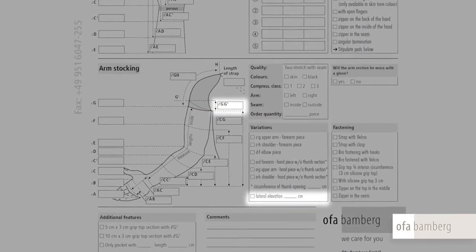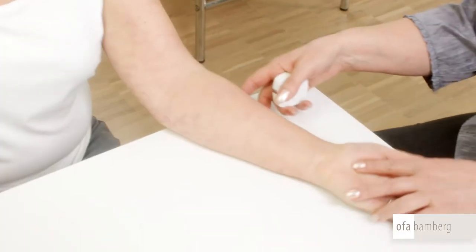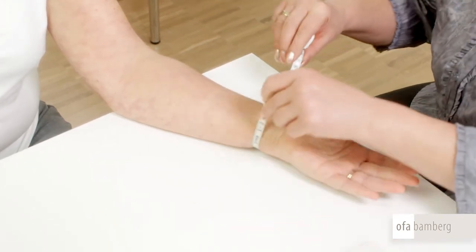The length to point GG1 is only determined if the arm stocking is to have a lateral elevation. If the other arm requires a stocking, begin the same measuring procedure for that arm.